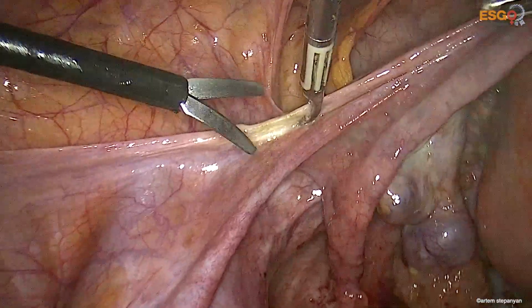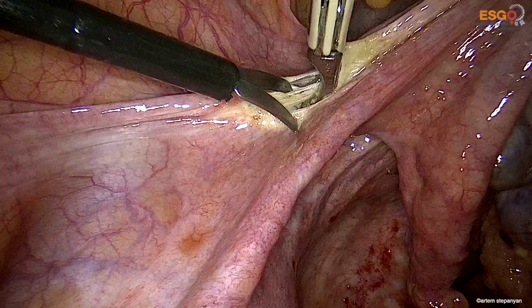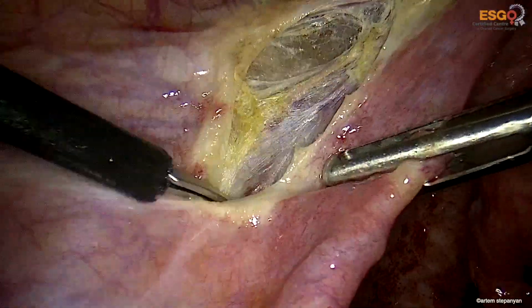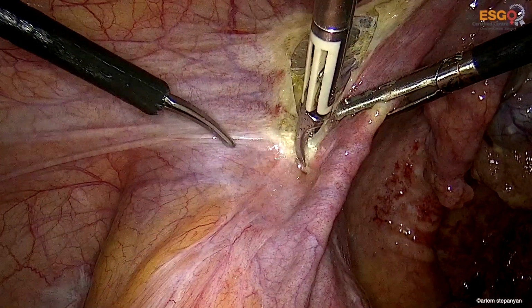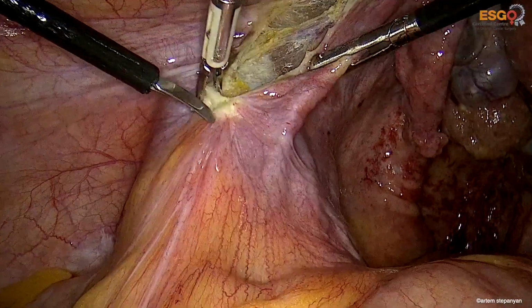pelvic peritonectomy. The procedure was started with coagulation and cutting of the left round ligament of the uterus, and then the incision of the peritoneum was advanced caudad, parallel to the vessels of the left IP ligament.